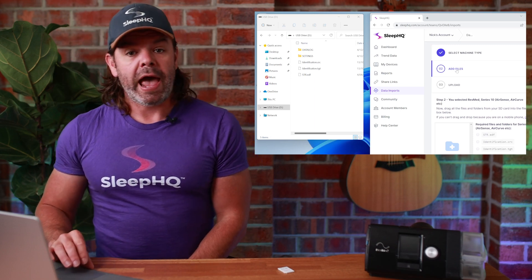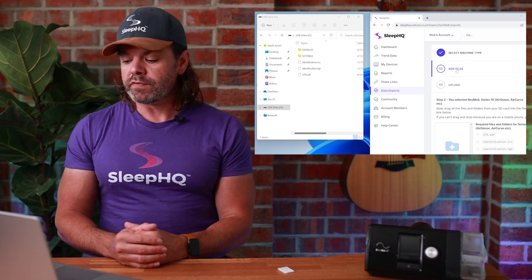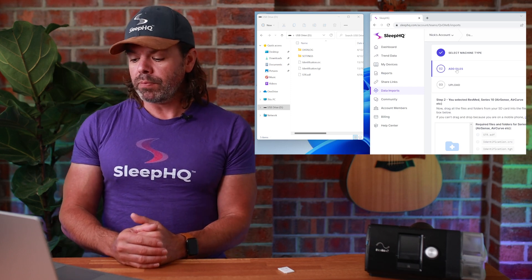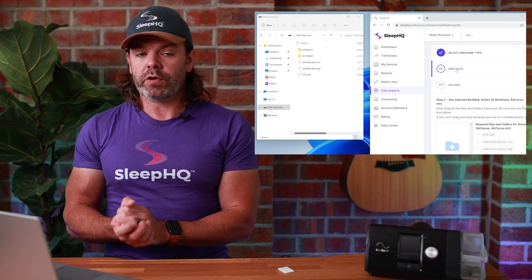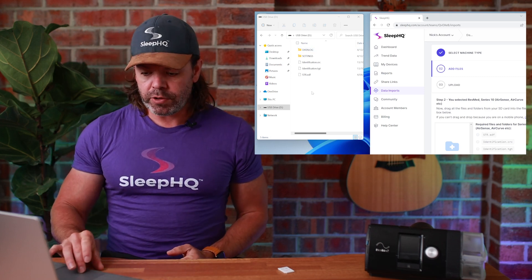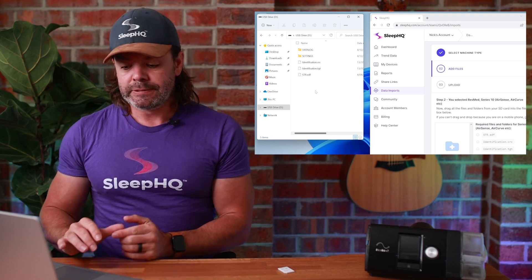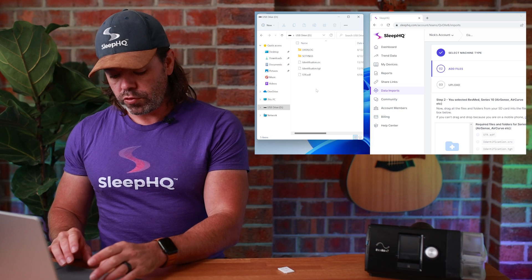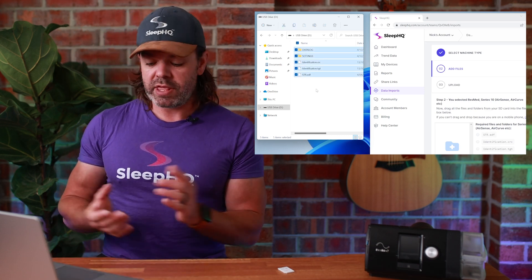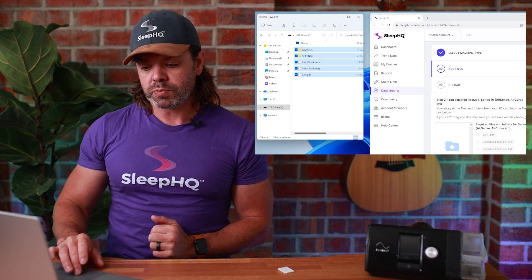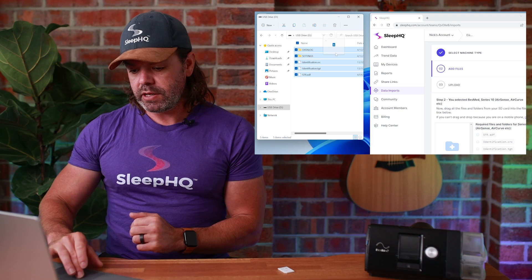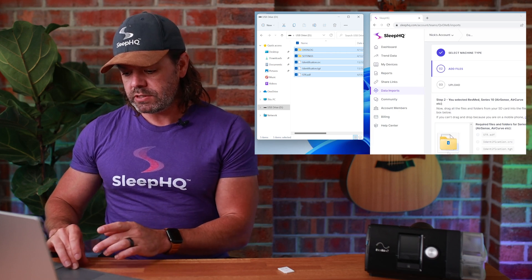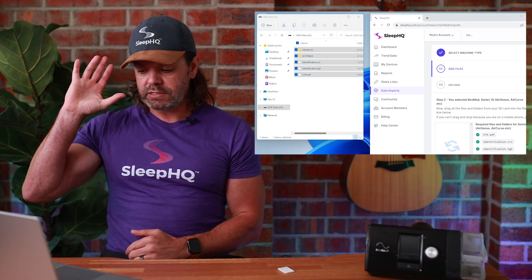Step two, add the files. Now drag all the files and folders from the SD card into the file upload box below. If you can't drag and drop because you're on a mobile phone, click here. While we're on a laptop, so we can drag and drop. So come across to where your SD card files are located. You can do Control A, which will select them all. That's probably the easiest. Or you can also click and drag your mouse over all the files. You can see they're all selected now, and I'm just going to click and drag them across. You can see it's dragging five files into this little box here, and then release.